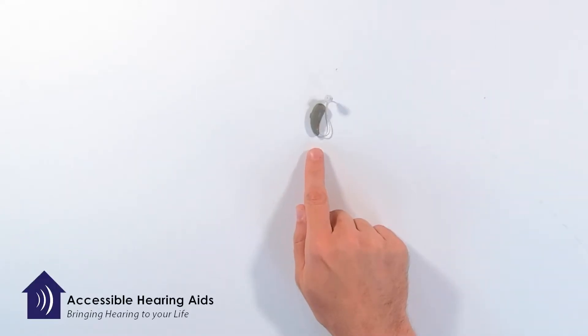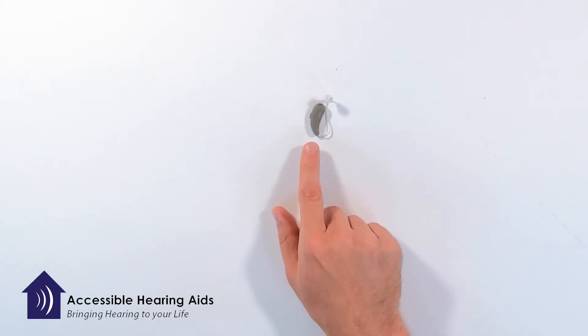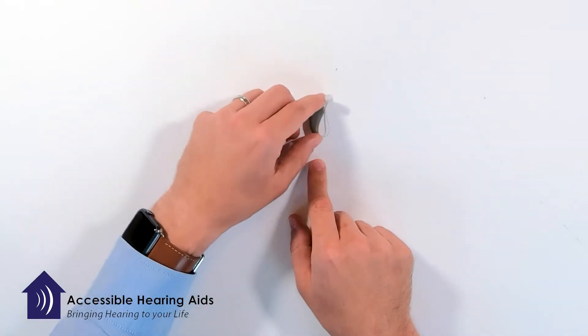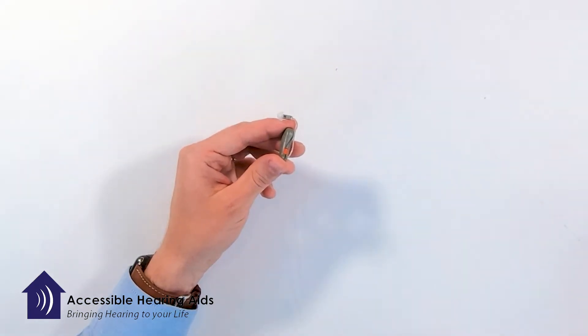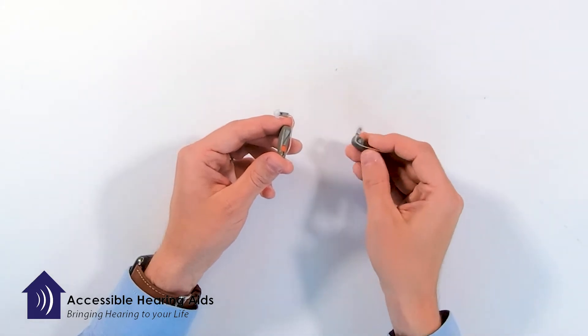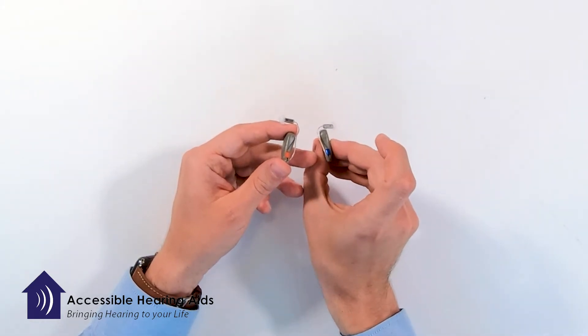Today I have a receiver in the ear hearing device and I wanted to show you how to insert and then remove the hearing device. One of the things to look for on any hearing device is the color that you have. This one is red for right and this one is blue for left.